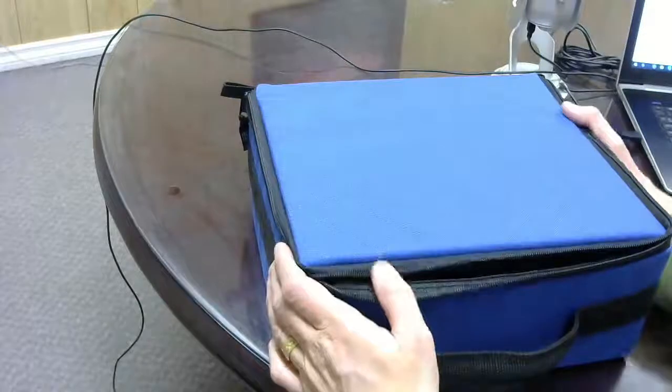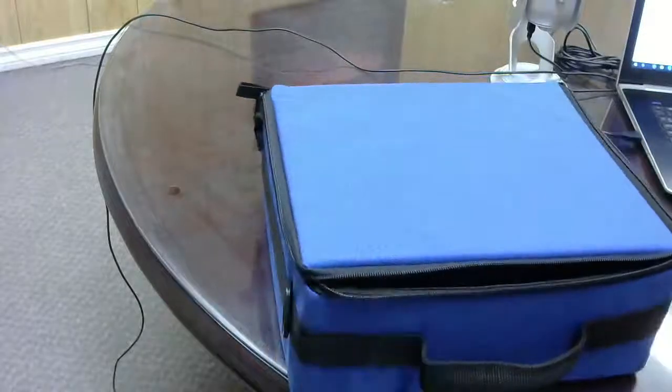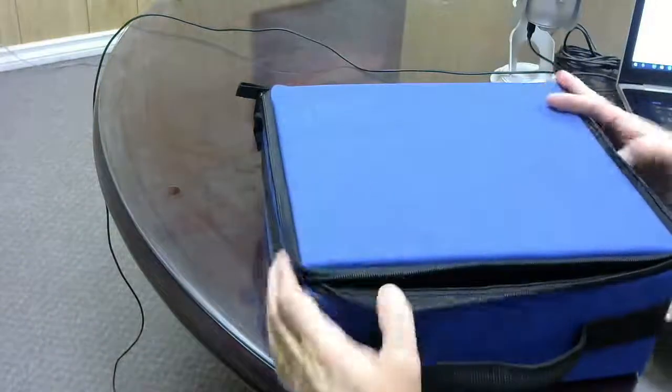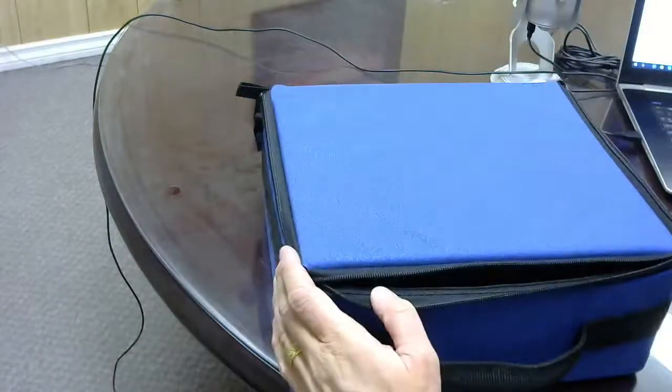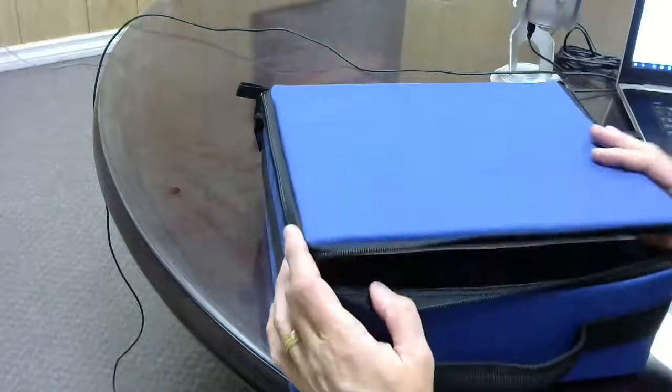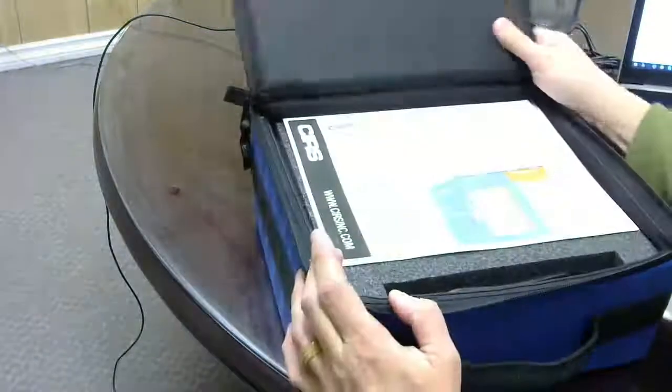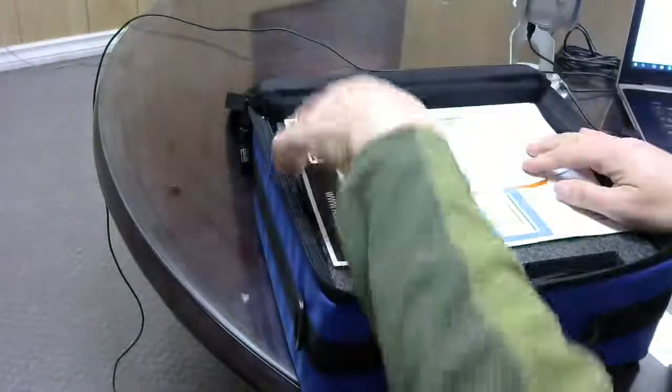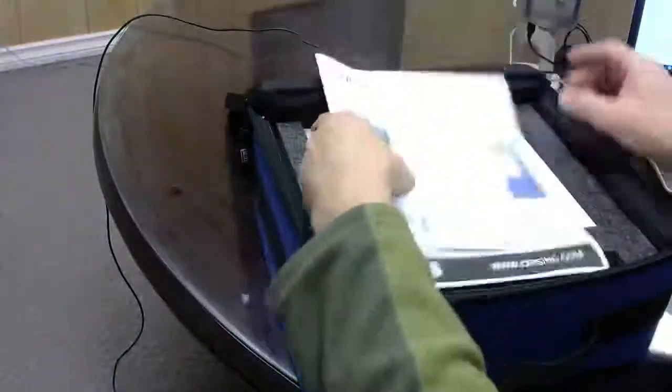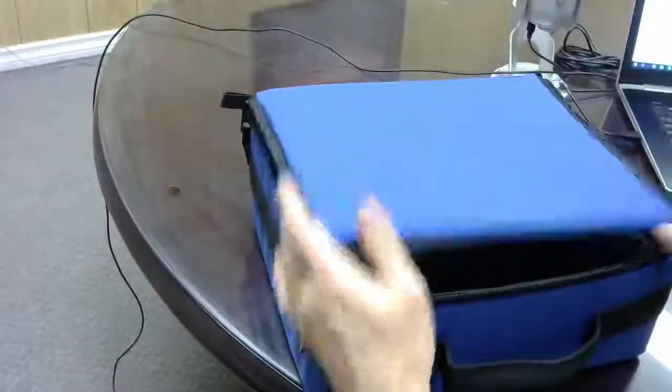All right, Steve Jensen here from CSP Medical. Today I'm going to be showing you the ATS model 539 ultrasound phantom, and it's kind of an unboxing. So this is the case that it comes in.